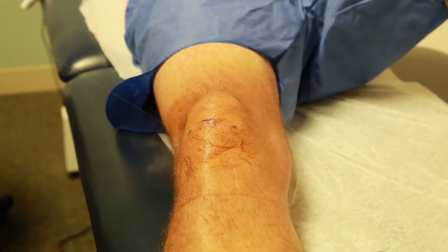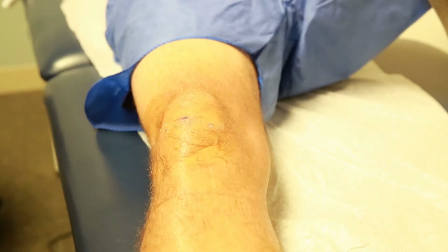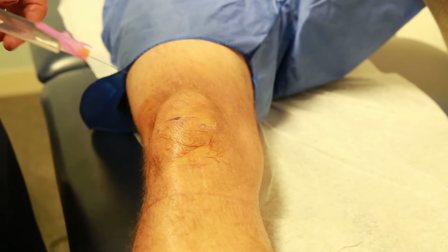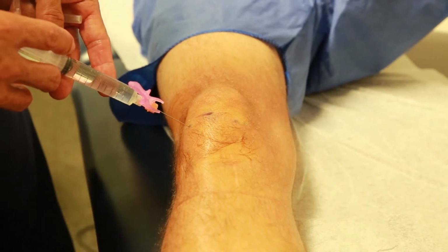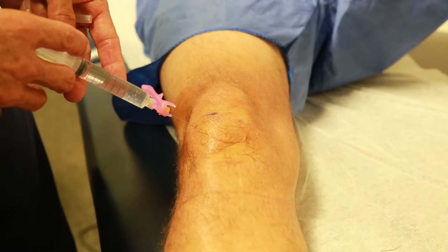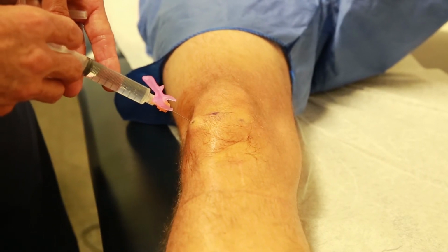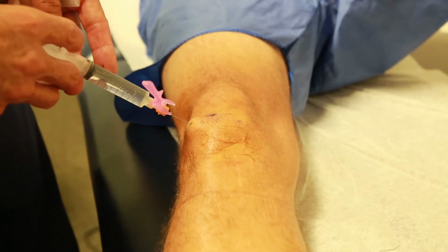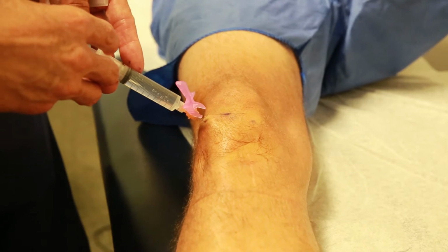We often will spray just to help a little bit of the pain. This is just regular 0.5% Lido with epi. Now a little bit of stick, Jason. So a little stick, and we just want to numb this up. Now make a nice wheal in the skin, and then we go down, and you're going to feel a little bit of discomfort as we get to the fat pad.